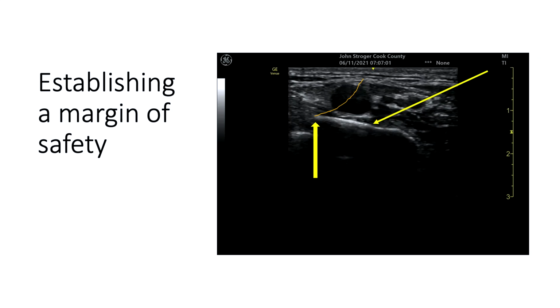So they produce this image, and then they check it. And then when they bring the needle, this next step is disconnected to this. So now, the only thing that matters to them is to see the needle. So when they find the needle, then they can't understand why I'm having a nerve breakdown.